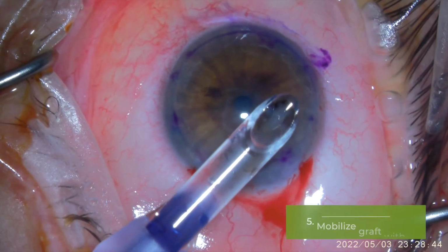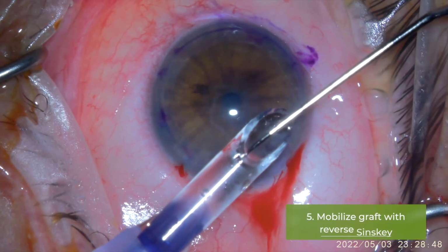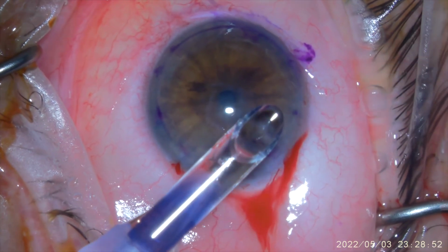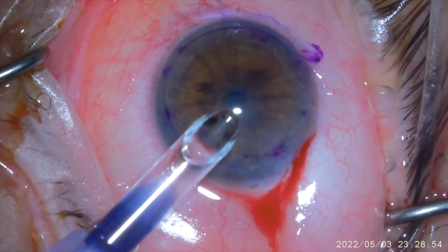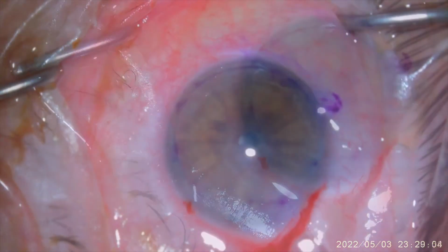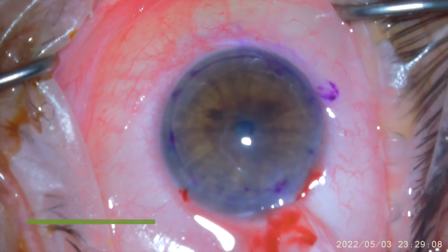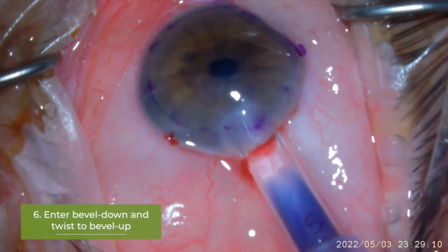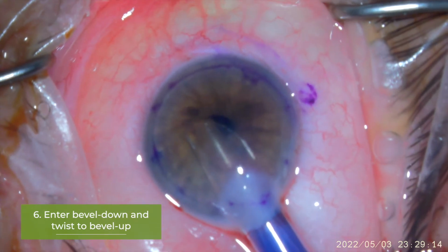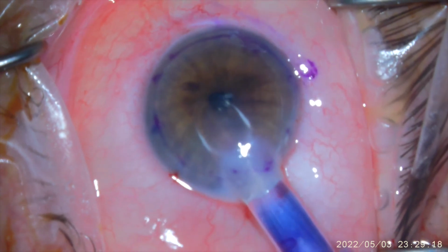The next step is I will take a reverse Sinskey to gently nudge the tissue a little bit towards the bevel just to loosen up any adhesions that could be between the stroma and the Weiss cannula. Because the incision is 3.5, I can very easily go in bevel down, and then twist once I'm past the pupil to make the cannula bevel up. This is the same way that I do DMEK as well.